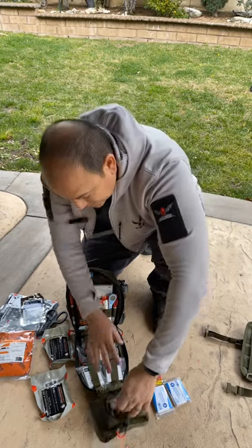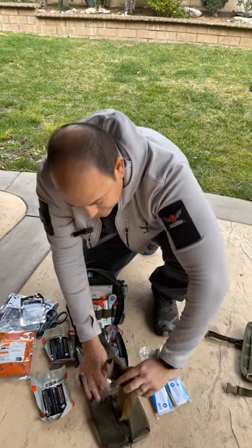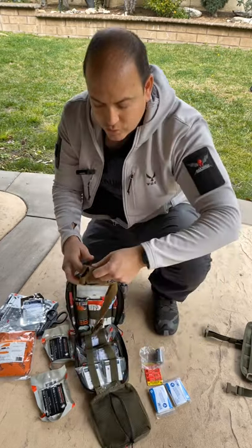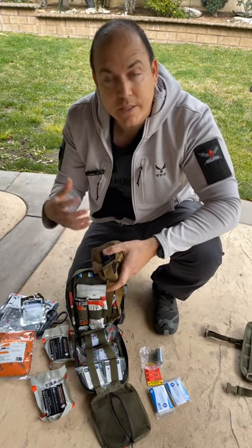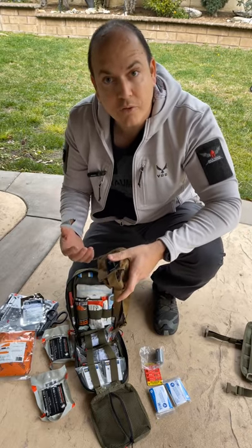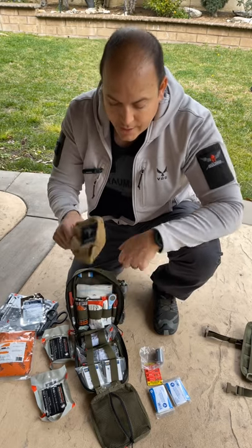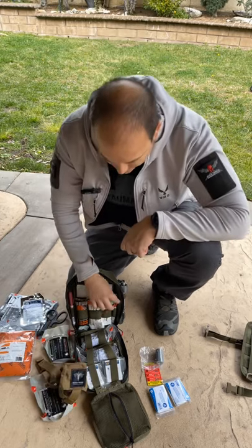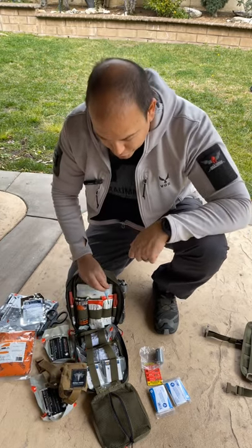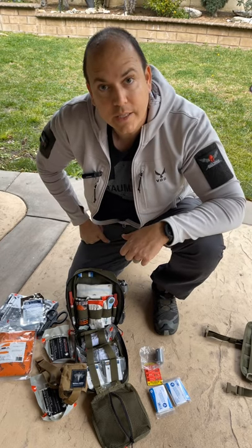There's also duct tape in here. Two items are specifically for the canine: the adjustable tactical muzzle by Tactical Medical Solutions — which will likely go on early in the treatment phase since the canine may be a danger to themselves or others when scared and hurt — and our eight-second thermometer, so you can monitor the canine's working temperature and make sure they're not getting hurt.